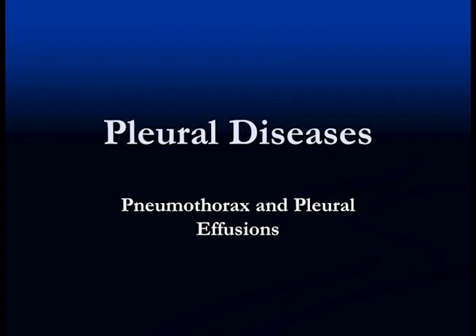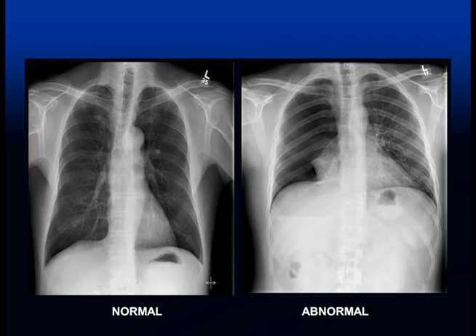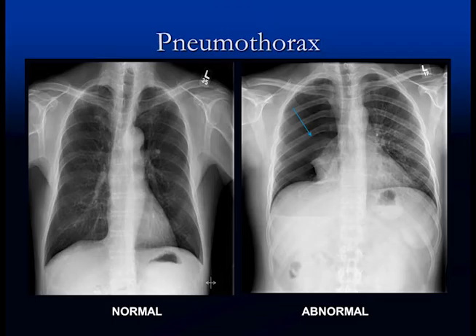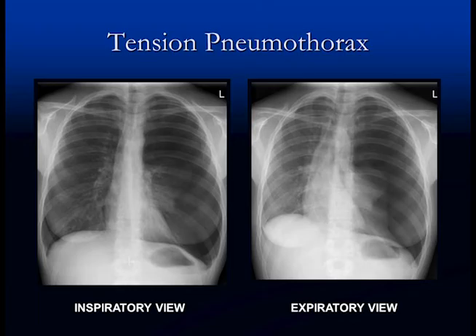Now we're going to talk about pleural disease — pneumothorax and pleural effusions. This is the same patient: a normal chest on the left and after a pneumothorax on the right. The whole lung on the abnormal side is collapsed — this is all air, and the white structure in the middle is the collapsed lung — with an air fluid level at the base. Any time you get a pneumothorax with a little fluid, you get an air fluid level. The left lung is unremarkable with no mediastinal shift, so this is a straightforward pneumothorax.